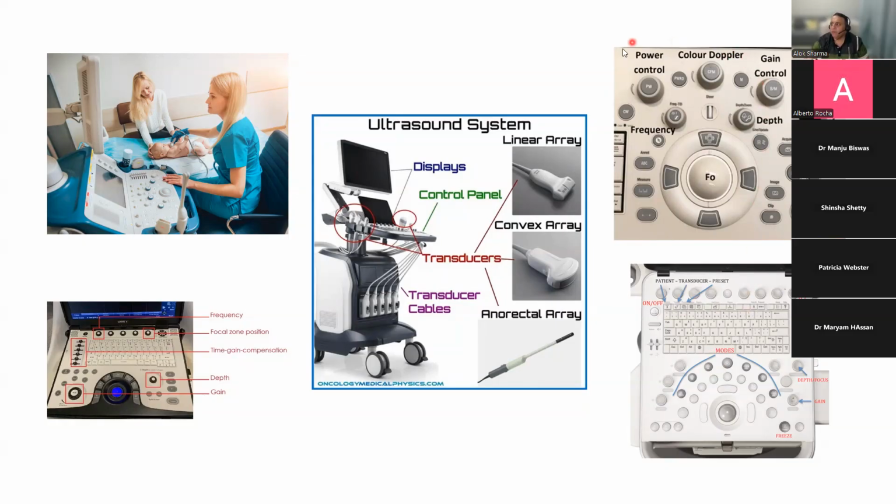So as we go up, this is what any standard ultrasound machine will look like. It will have a button for frequency. Now, if you select a preset, a preset might mean that in a term neonate, you're selecting a depth of 7 centimeters with a preset frequency of 7.5 or 8, with a focus that is usually kept, if you're doing a coronal image, at the level of the corpus callosum in the midline. So that preset from our perspective is already set to run.